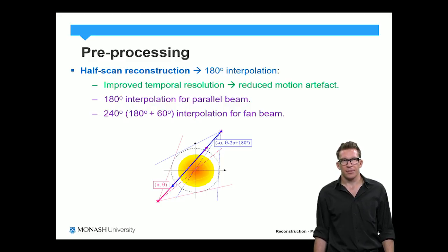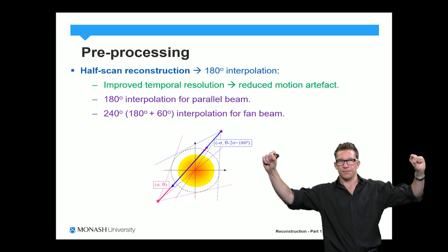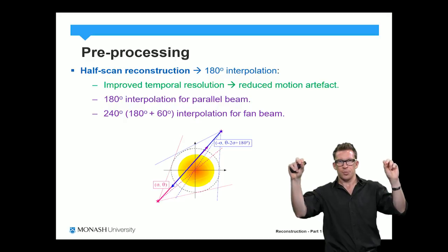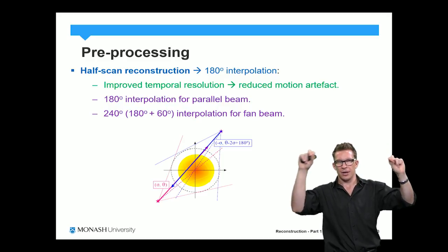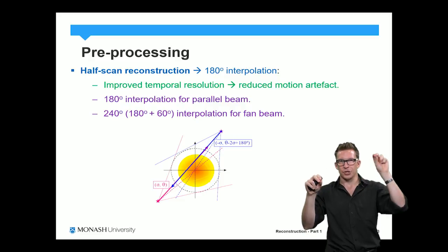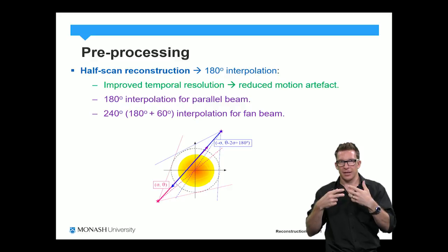Okay, so there's one other consideration with interpolation. You can imagine that if I'm interpolating between 2 points, and I spread those 2 points far apart, now as the CT scanner is rotating around and acquiring data, if those 2 points are far apart and I want to interpolate to a data point in the middle, if I've got bone here and soft tissue here and I interpolate between those 2 points, I'm going to get a point in the middle that's a weighted average of the bone and the soft tissue. Now if that point in the middle is actually bone or is actually soft tissue, the value that I synthetically generate is going to be far off.